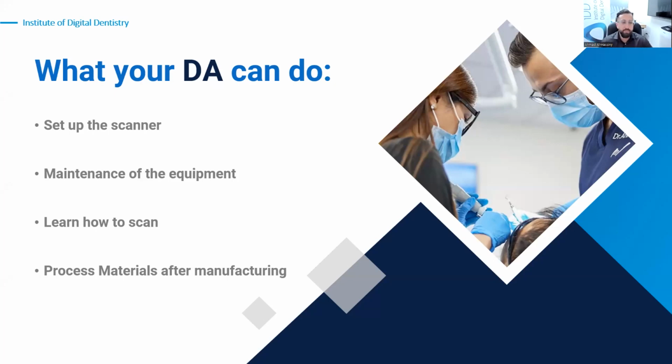Setting up the scanner, maintenance of the equipment. You can teach your DA to scan. From my understanding, in most regulatory bodies around the world, a DA is allowed to scan. They're not manipulating any tissues. It's basically a camera. Once you teach your DA to scan, that opens up a lot of different workflows that you can incorporate in your practice.